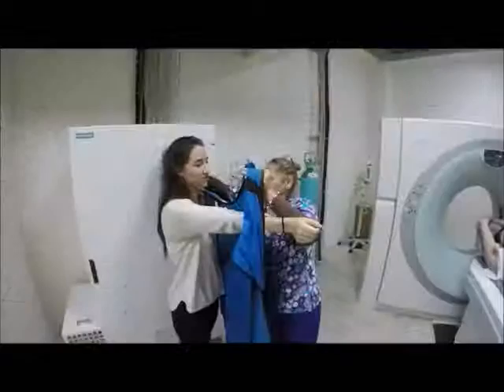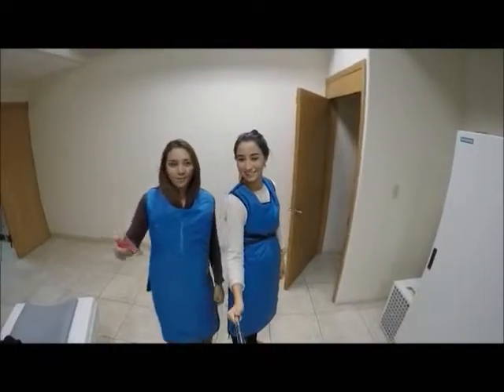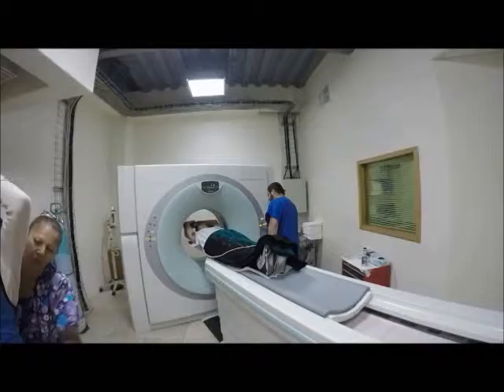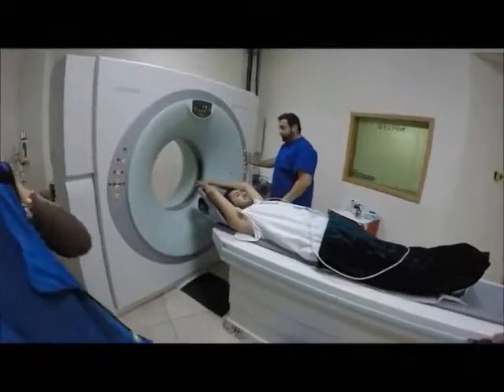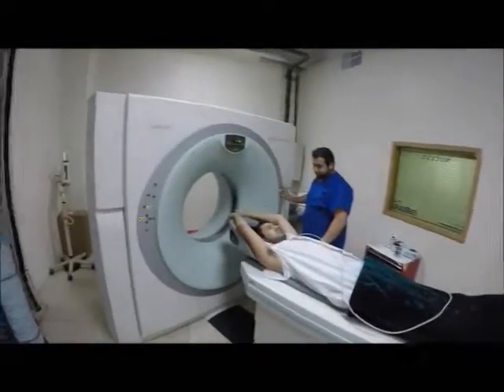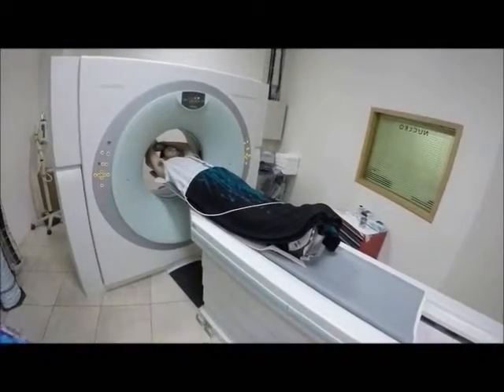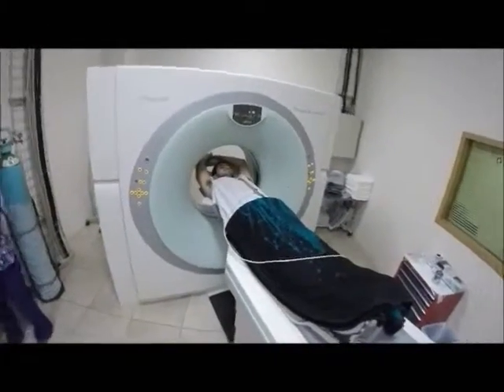Anybody in the room should be wearing protection during the procedure. While lying on the scanning table, you may be asked to raise your arms over your head for the duration of the exam — this will help improve the image quality. You may be asked to hold your breath during the scanning, as any motion, whether breathing or body movements, can lead to artifacts on the images.